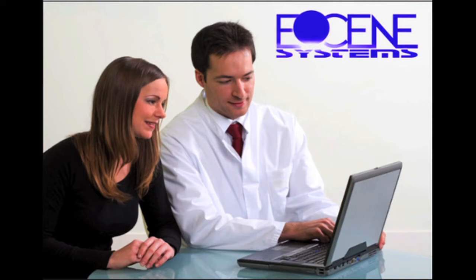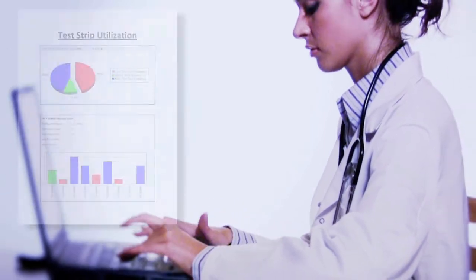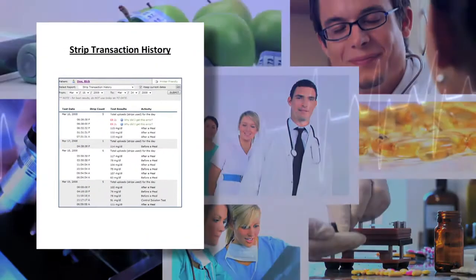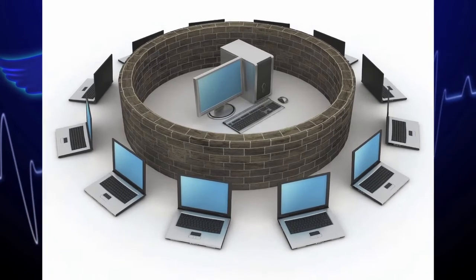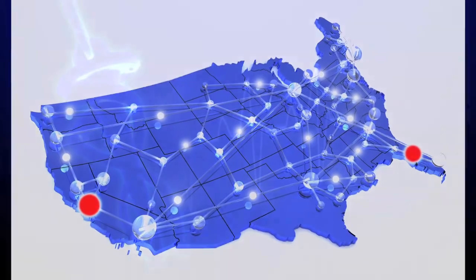All of these devices can share their real-time testing results with this comprehensive disease management system that is capable of manipulating aggregate data into beautiful, easy-to-read and understand charts, graphs, and reports. Security of this personal medical information is trusted to two HIPAA-compliant HL7 servers located in California and at our home office here in Titusville, Florida.